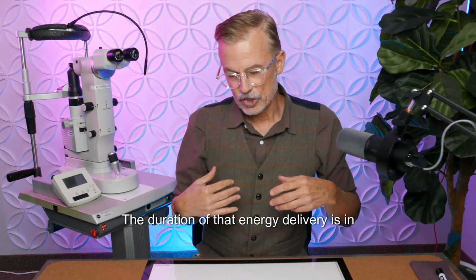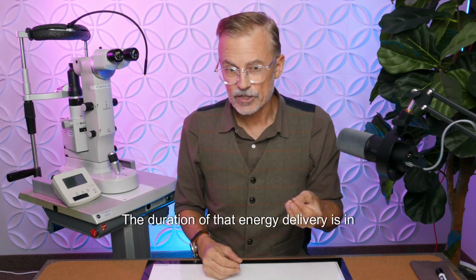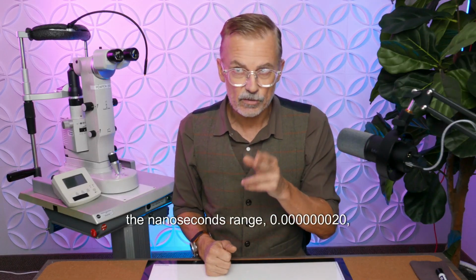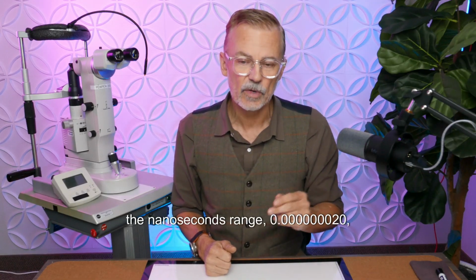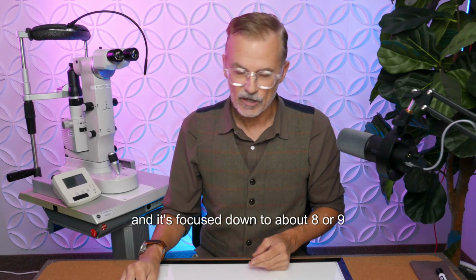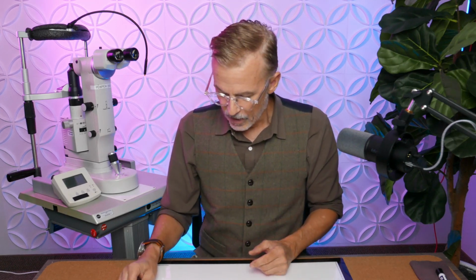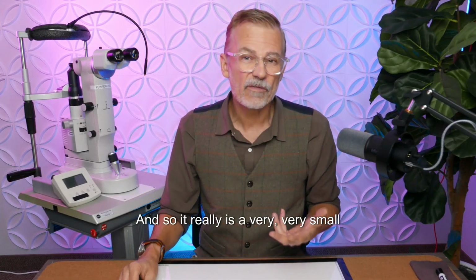The duration of that energy delivery is in the nanoseconds range, 0.000000020, and it's focused down to about 8 or 9 microns, which is really small. And so it really is a very small amount of energy.